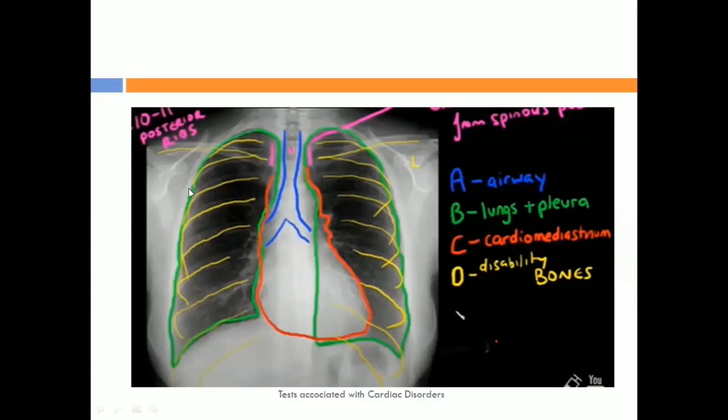This is how any chest X-ray will appear, and this is the left side and this is the right side. So now we'll see a video of how it happens, right?